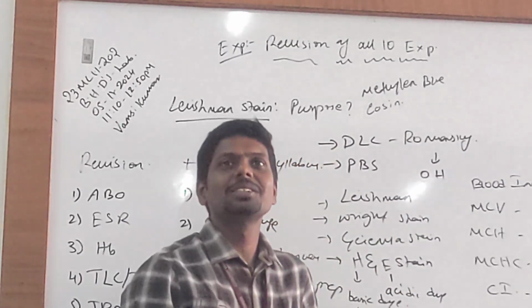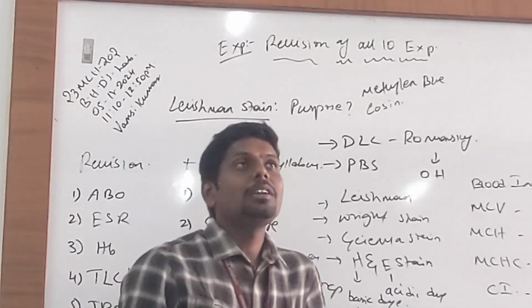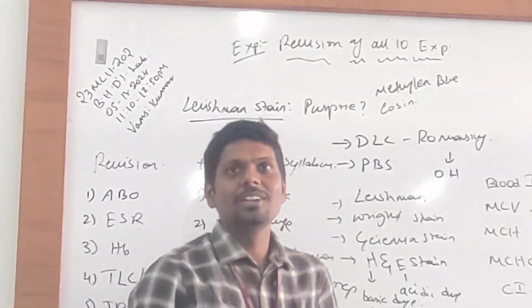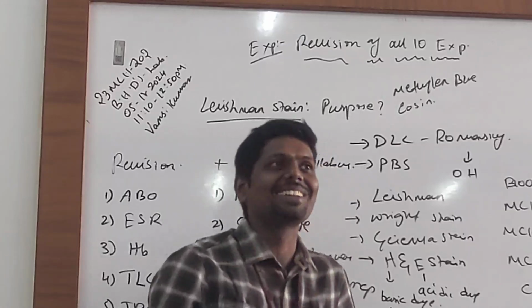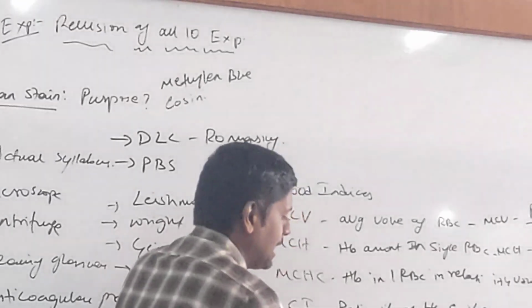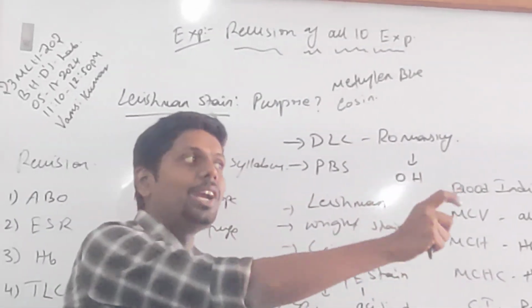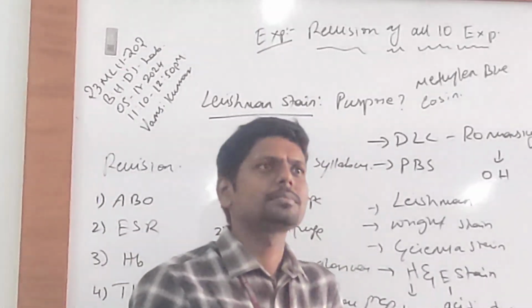Any other lab test? RDW. Everyone clap for Ria now. Very good. Because RDW we just discussed. In RDW you might get an abnormal value. It might be decreased. Very good. Red cell distribution width of the red blood cells. Any other lab test you will perform?